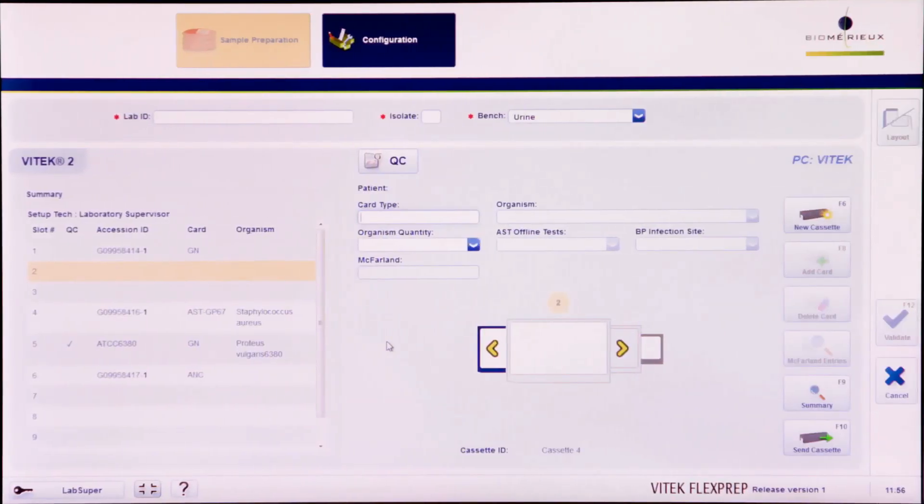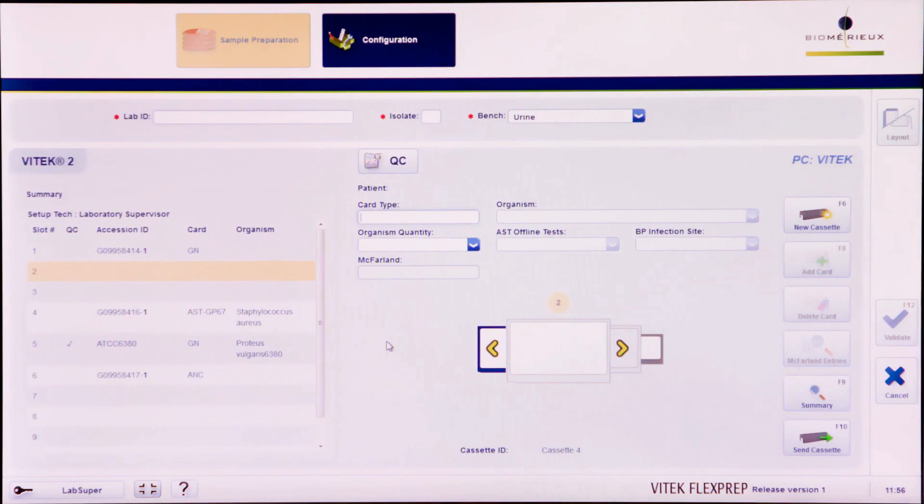Before sending the cassette to the instrument, it is good practice to click the Summary button or press F9 to access the cassette summary screen for reviewing card details. Ensure that the software matches the physical cassette.